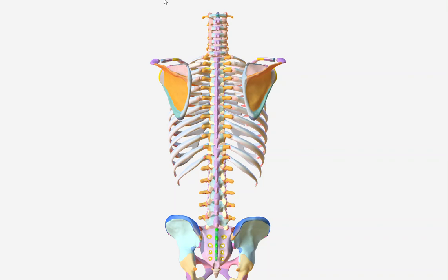Hello everyone, welcome back. I just wanted to do this video about positioning of the patient. Going through the oblique positions and the lateral positions, how we name them, how we would use our left or right marker for those positions.